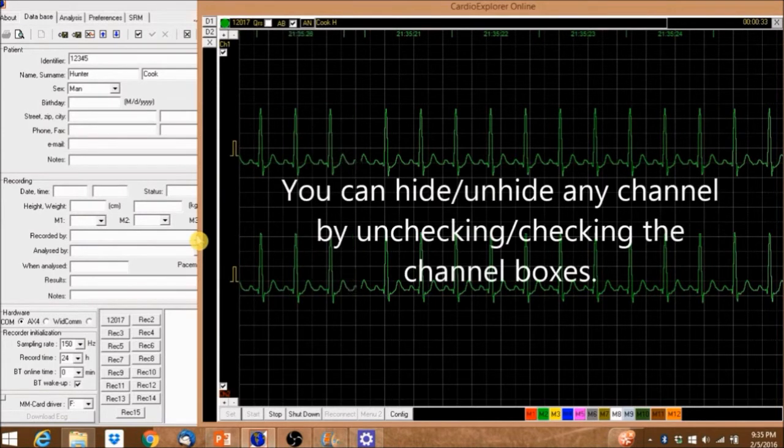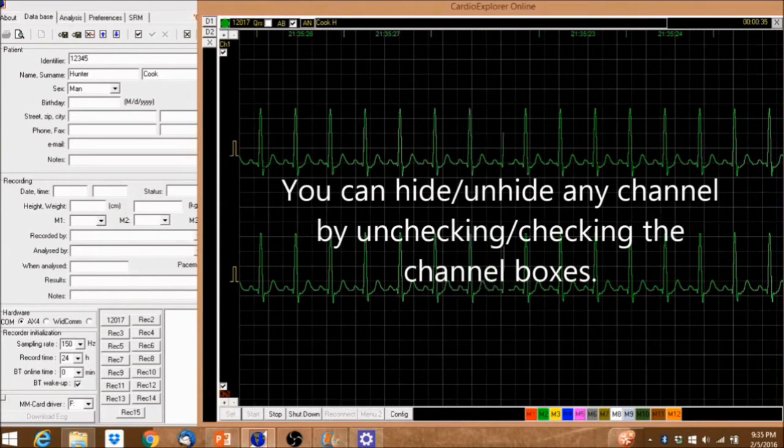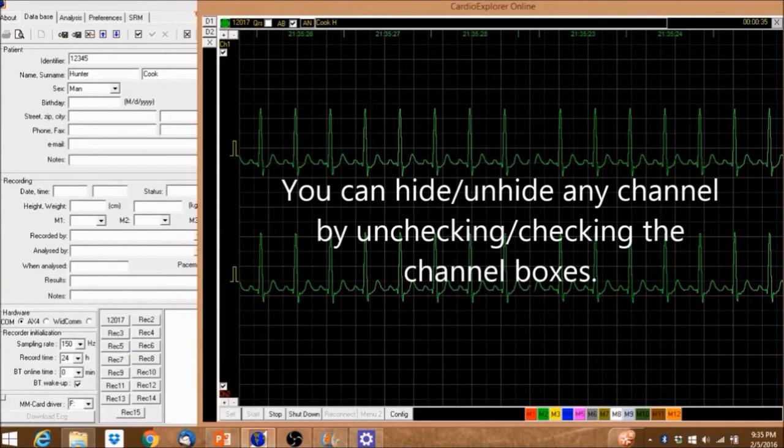You can hide or unhide any channel by unchecking or checking the channel boxes.